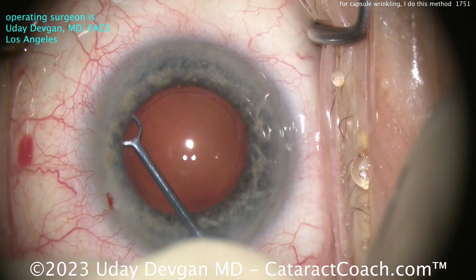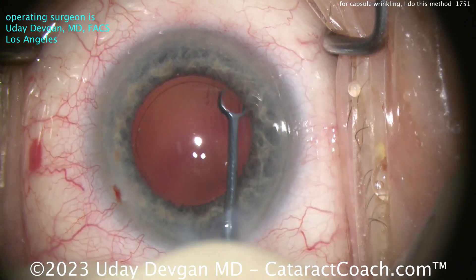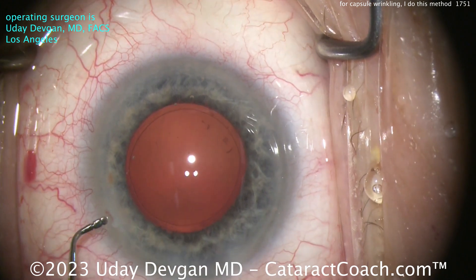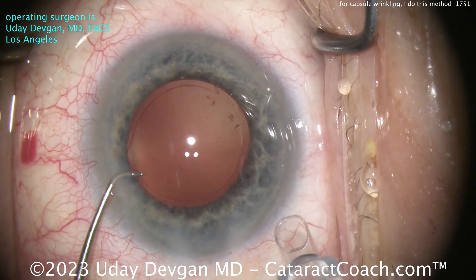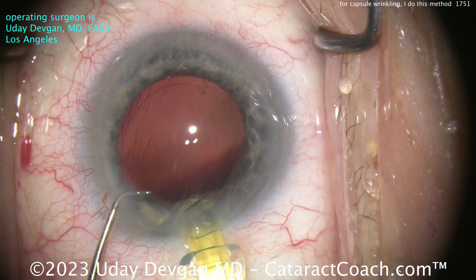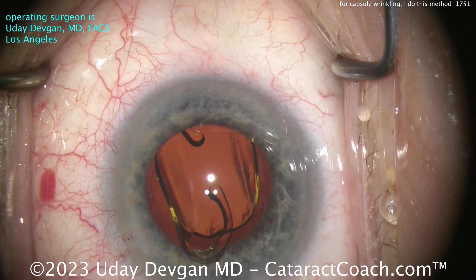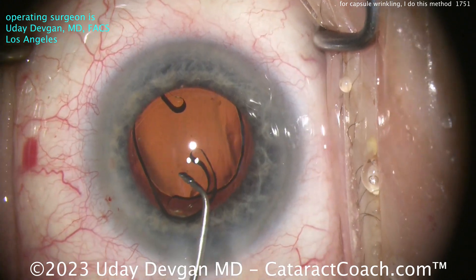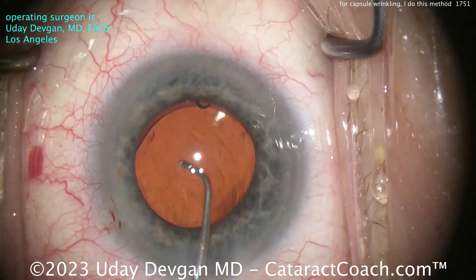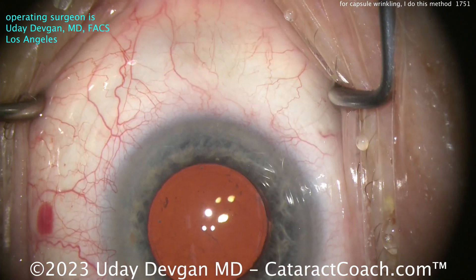Here comes the capsular polisher — I want to deliver a beautiful result. A little bit of lens material is brought off the underside of the lens capsule. Here comes the IOL — a single-piece monofocal acrylic lens, aiming for a target of plano for best distance vision. I'm happy to say this patient achieved 20/20 vision. Going in nice and easy, beautiful. With a loose bag like this I don't want too much manipulation — gently in the bag, minimal manipulation, rotate just a little bit, get the haptics opened up.